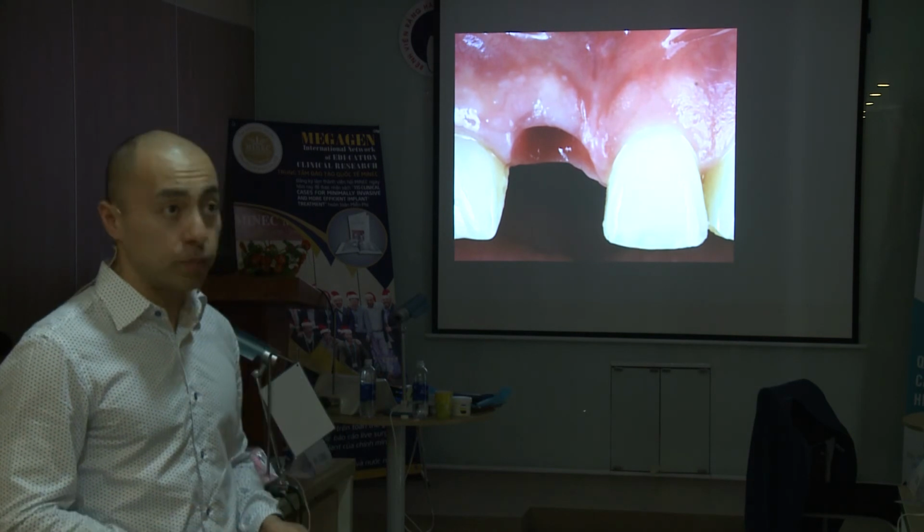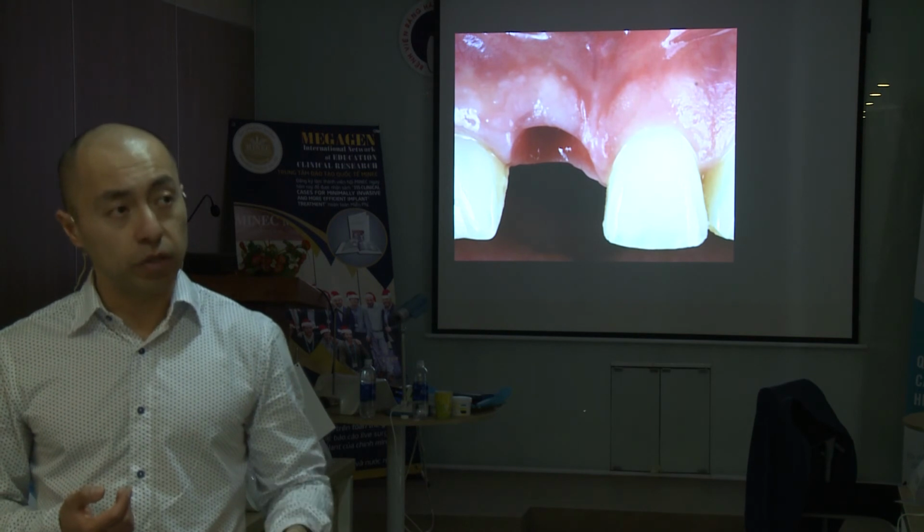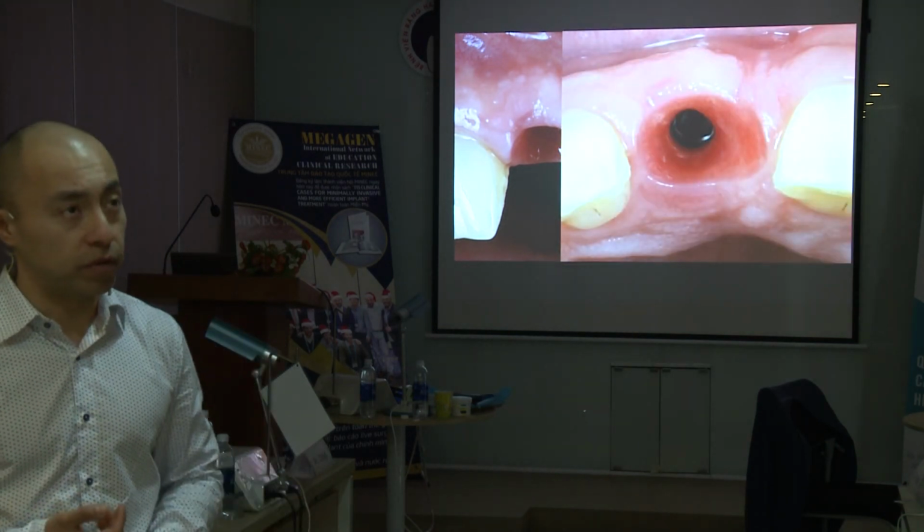Because only with the temporary crowns I can create the soft tissue as an emergence profile and the cervical profile.